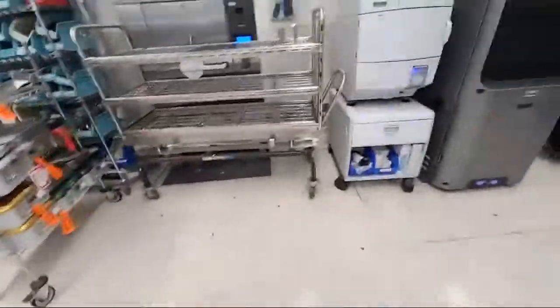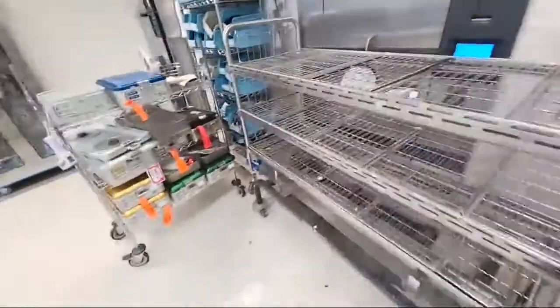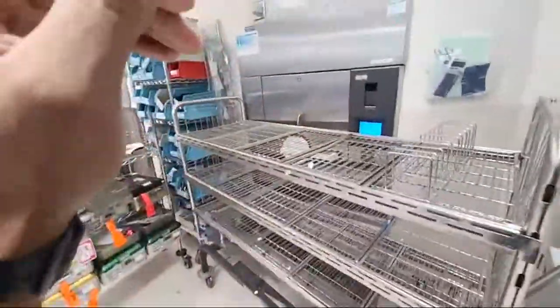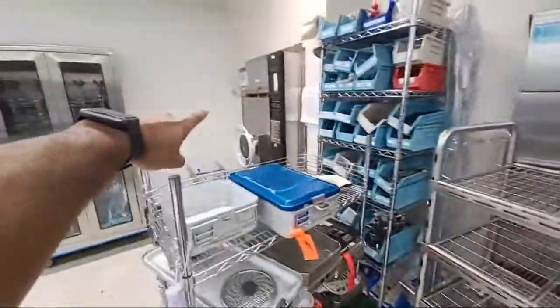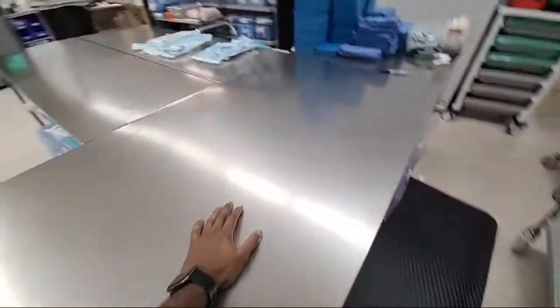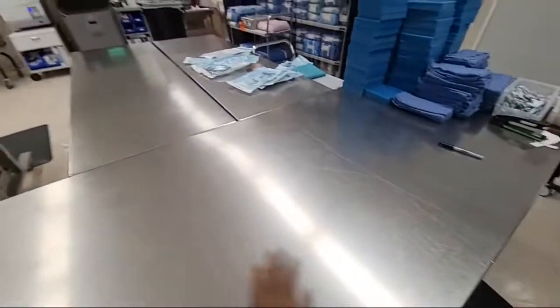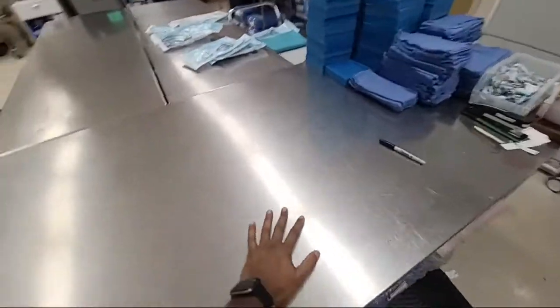And after they're done, they are either placed on this, and then we push it into the steam sterilizer if they're to be steamed. If they're not in a container on its own, we send them over here to prep and pack. Sorry, this whole area is kind of like prep and pack. I just keep calling assembly separate, but prep and pack. So here's the pack part.